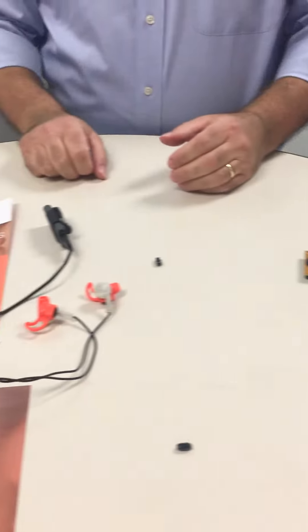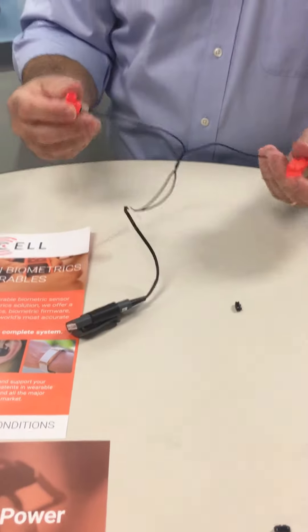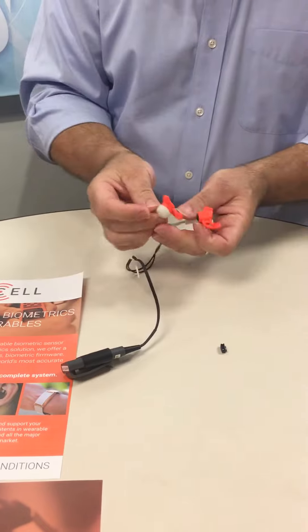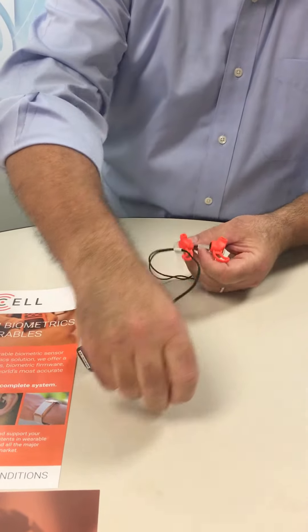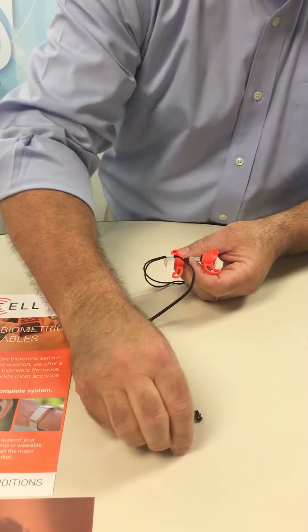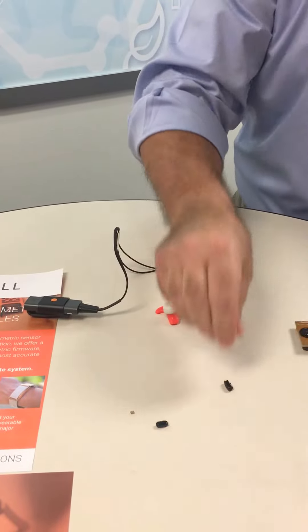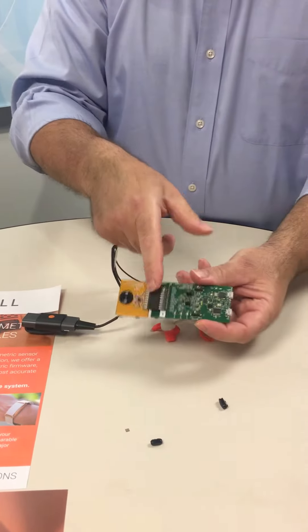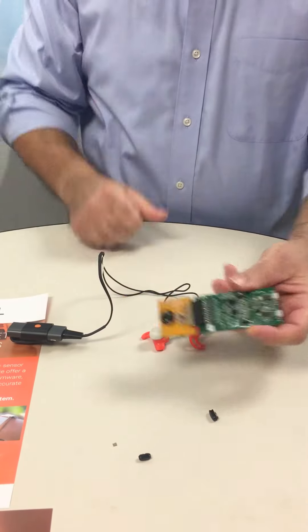Our benchmark ear products have a different style of evaluation kit. It's a complete full audio biometric reference design with a dual mode radio included. We also give you a sample of the sensor — this one is benchmark ear 2.0. It comes with a microcontroller that is not attached; you have to put it on your circuit board. It also includes the USB development board, except with a daughter card that has benchmark ear on it.